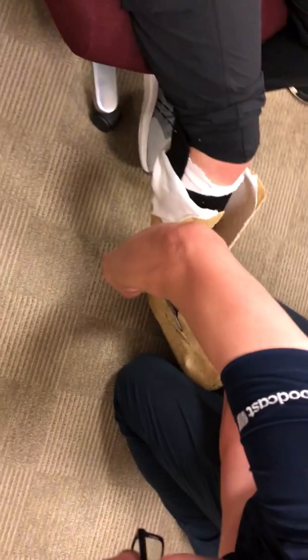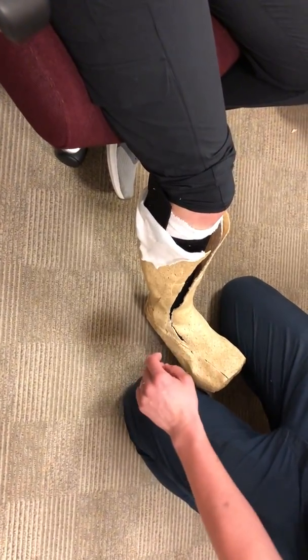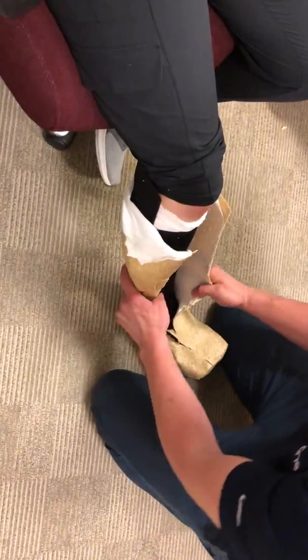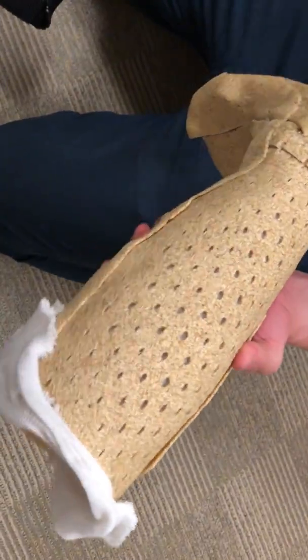For people that do this a lot, this is probably the... This is still reusable. Wow. So you can heat up this again. Yeah, that's really, really terrific.